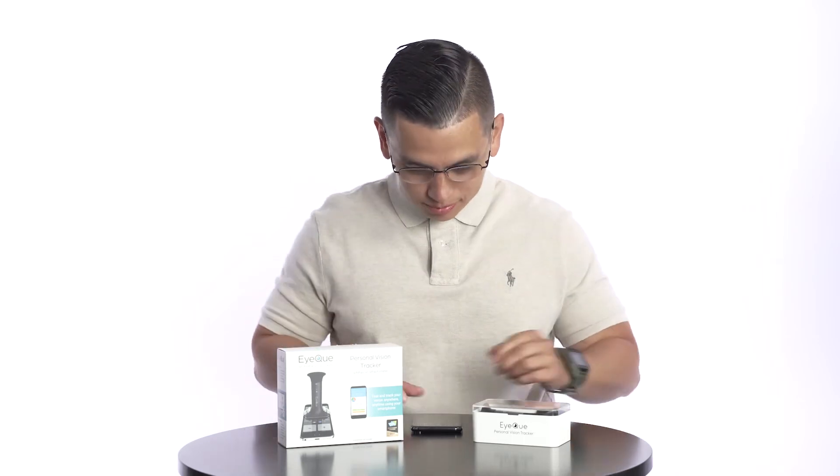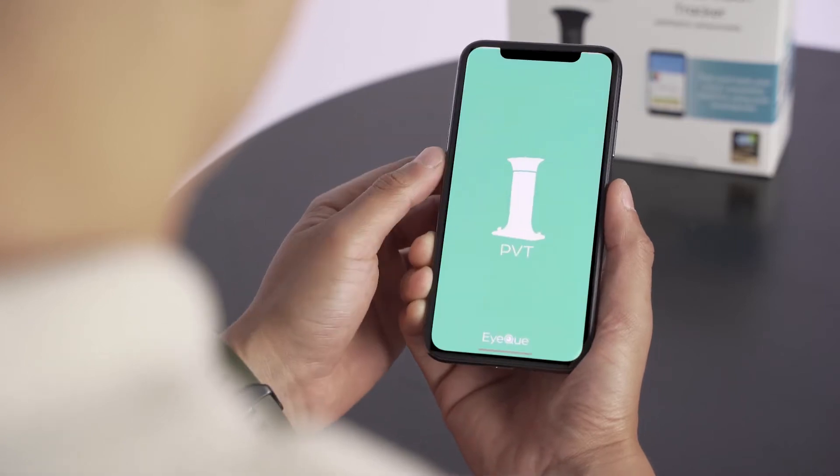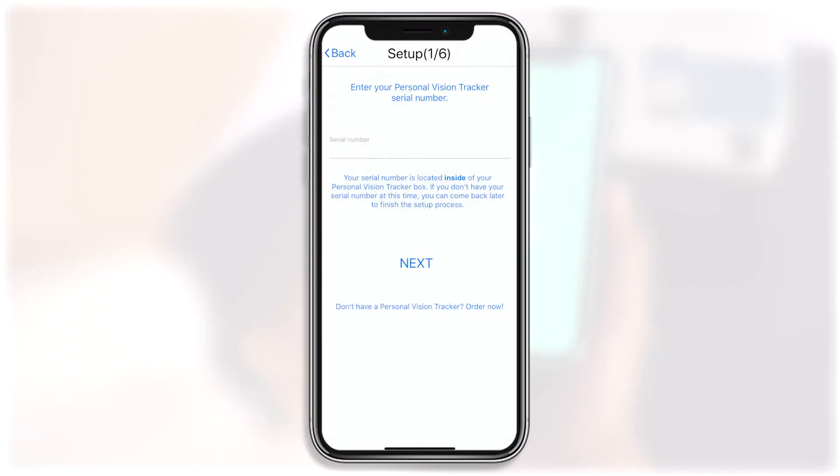To get started with your Personal Vision Tracker, launch the PVT app and log into your account. If you do not yet have an account, register and enter your serial activation number to gain access. Please be sure to confirm your email address before signing in.